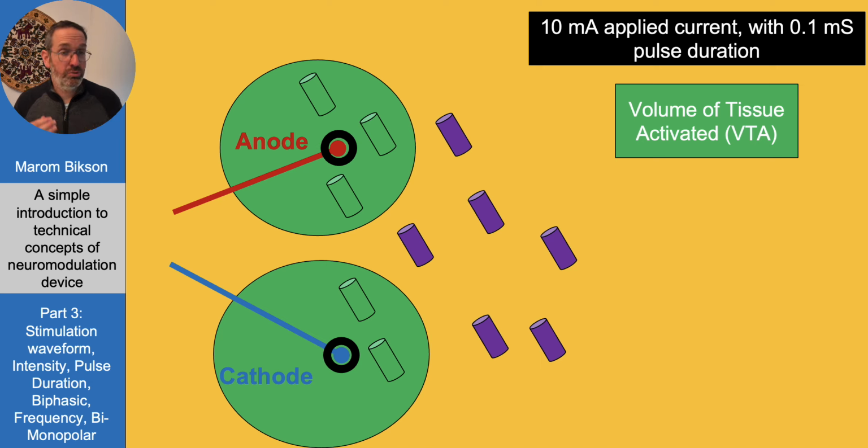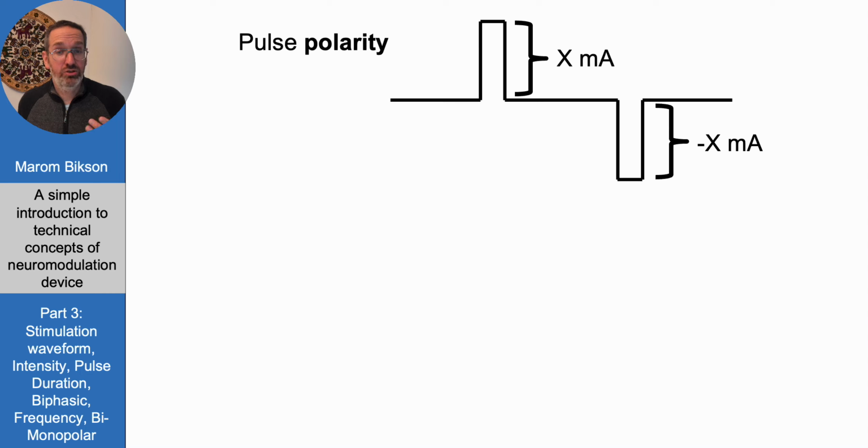And so this is why it is so important to consider both intensity and pulse duration. I've been saying pulse width, but pulse width or pulse duration, both matter. More intensity, more activation; more duration, more activation; less of either, you start to lose.